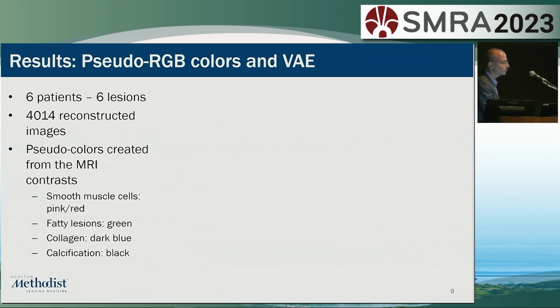Right? So, details here. And the interesting thing is also, we have 6 lesions. How do you get to 4,000 images? You get to 4,000 images if you acquire axial thin slices. You can actually use every single slice in training the algorithm. So that allows us to get to a high volume, really avoiding a large number of patients or lesions here. So it's really by the slices.